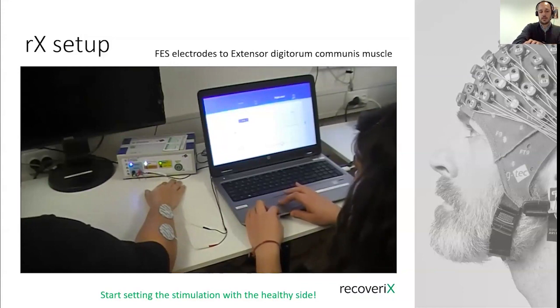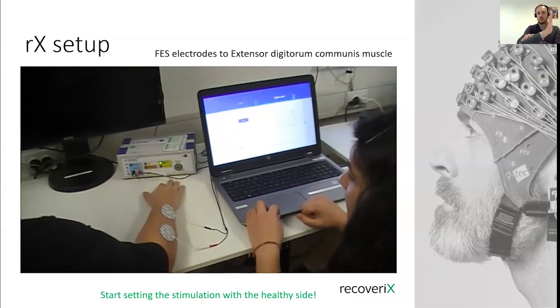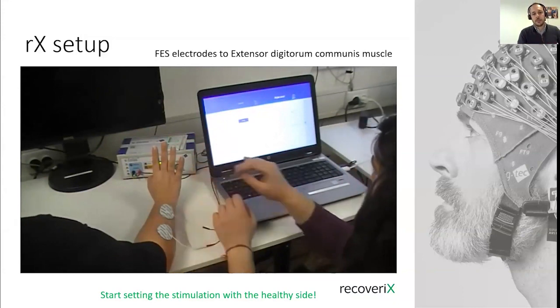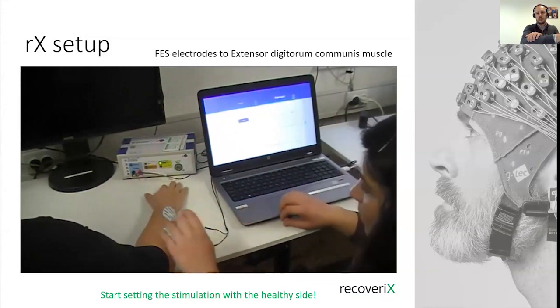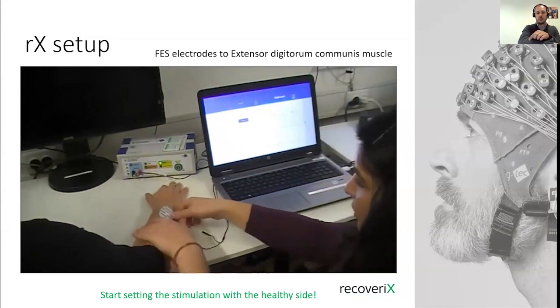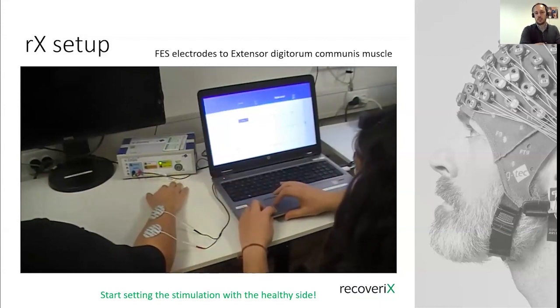Okay, the muscle gets activated by the stimulation, so the patient should not do the movement actively. We can see this nice movement where all the fingers are open, so are extended. Okay, this is a good movement. Sometimes it can be that we place electrodes too much on the lateral side, and maybe you see that the movement of the hand is going to the external side, or maybe to the medial side. So we have then to relocate the electrodes. So that's what the therapist is showing us in the video.